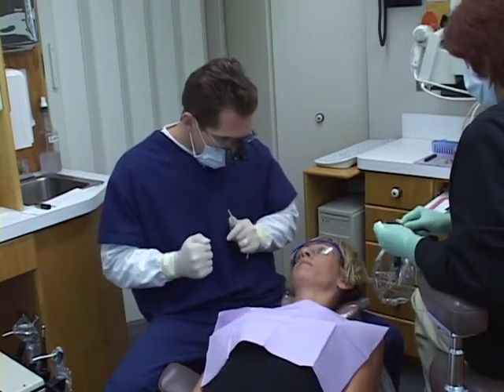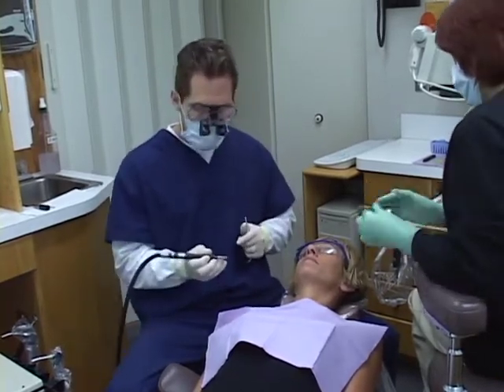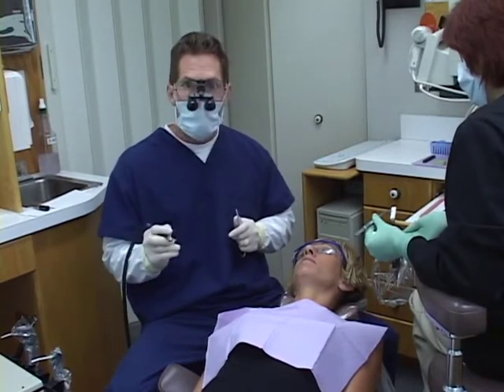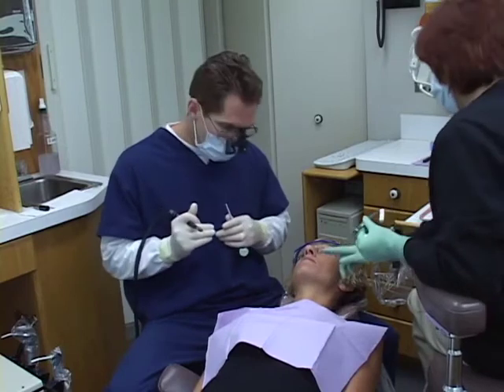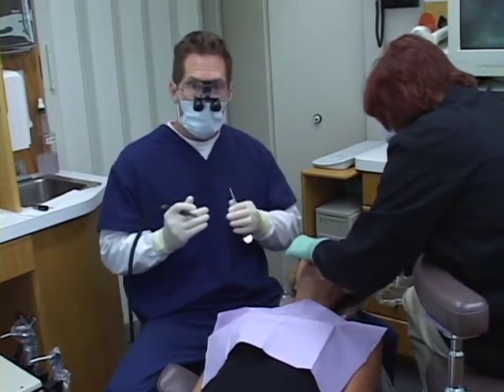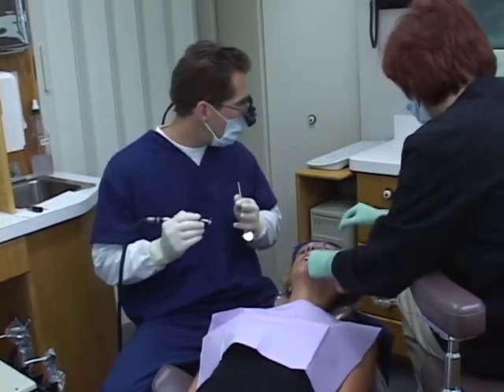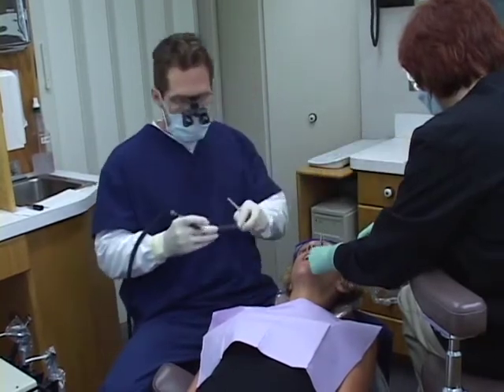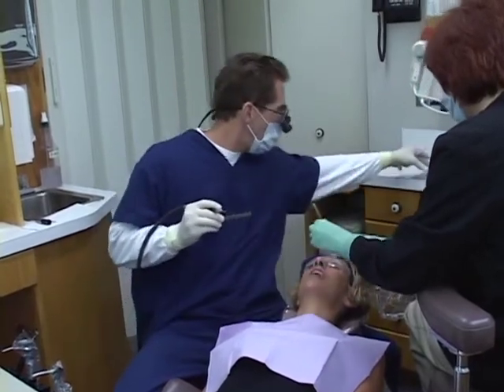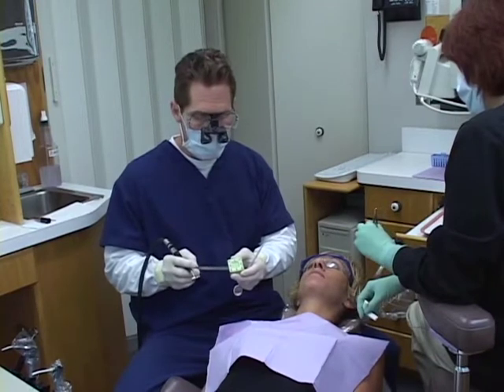Okay, Debbie? Mm-hmm. As we start here, my choice for most patients is to use a Brasseler 7406. It's a very nice 12 fluted finishing bar. With Debbie having very minimal amounts of reduction, we'll probably be using a Whitestone. Whitestones are very nice. They leave a very nice, highly polished area. They do very minimal cutting, and the nice thing is we can use a honing stone or a shaping stone and literally custom shape the Whitestone to however we want it to be. That works out very nicely.